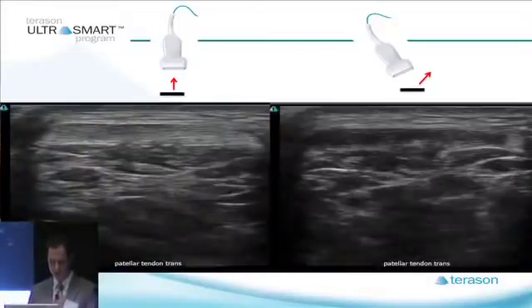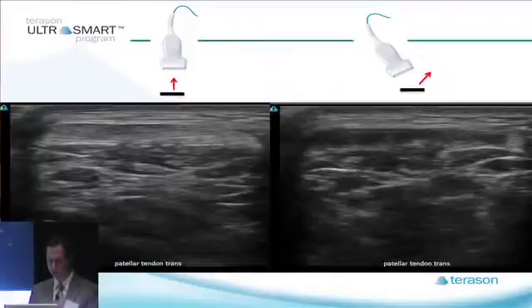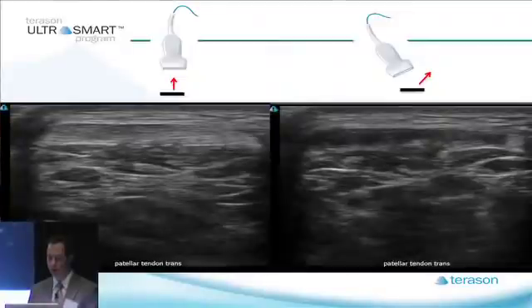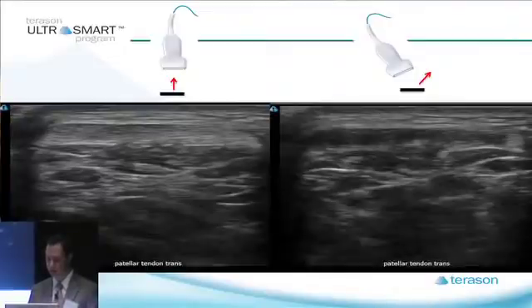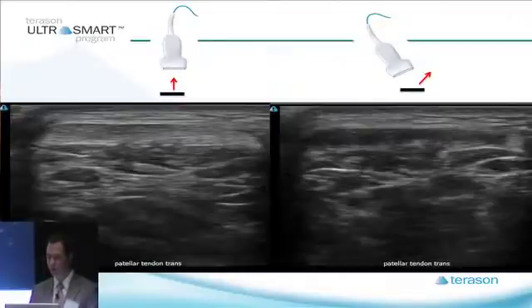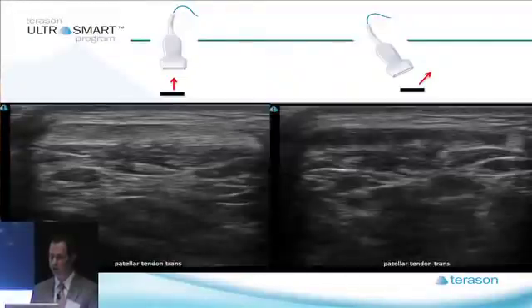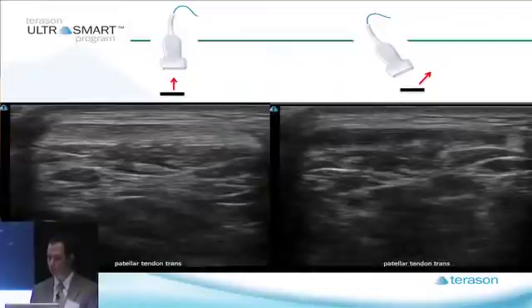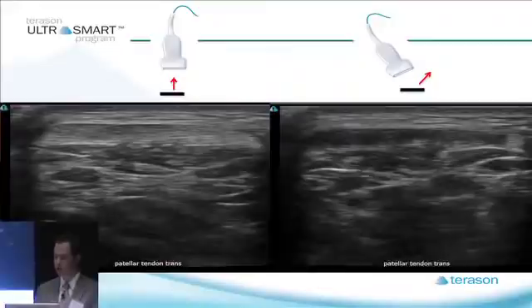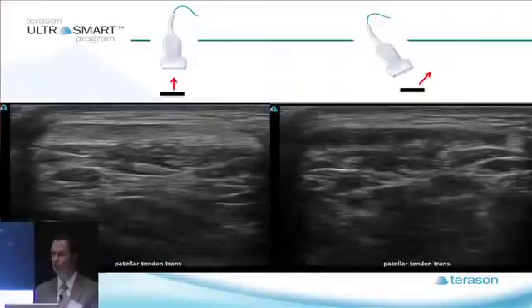Look at this cross section of a patellar tendon. On the left side of the screen, you see this sort of bright ovoid structure. And on the right side of the screen, you see this dark ovoid structure. The only difference is that on the left side, you've got a beam that is perfectly perpendicular to the structure of interest, and it bounces back to the transducer. On the right side, the signal comes down to the patellar tendon and bounces away.